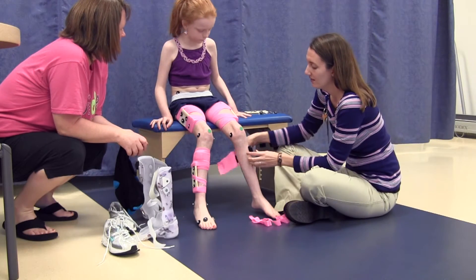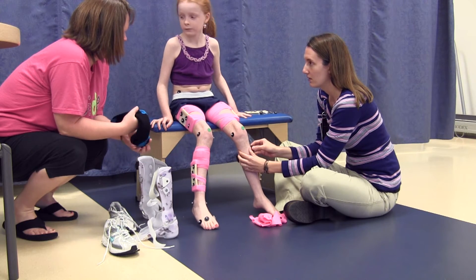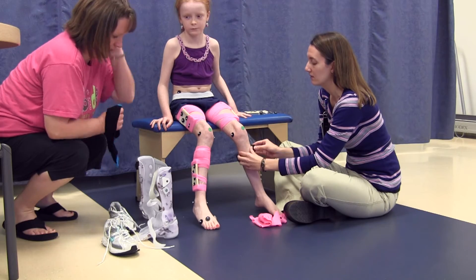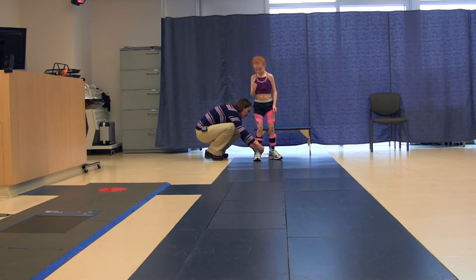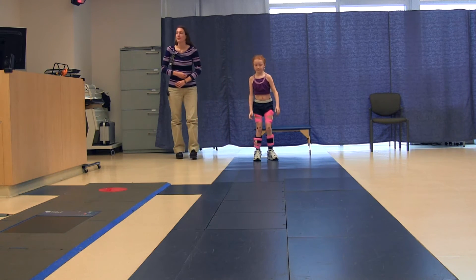If I wear braces on my feet at home, I will sit down on a blue bench so that the PT can help me put these on. The PT and lab assistant will have to take the stickers off my feet and lower leg so that they can put my braces on. Once the braces are on, the PT will have to put my stickers back on me, but this time they will go on top of my shoes.